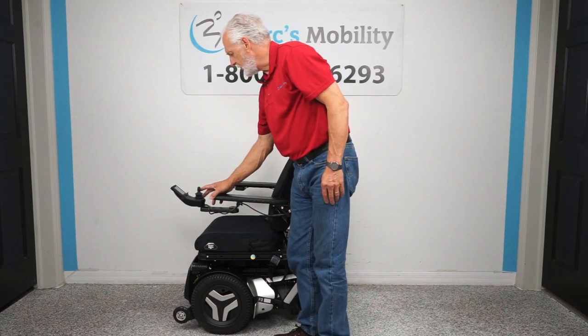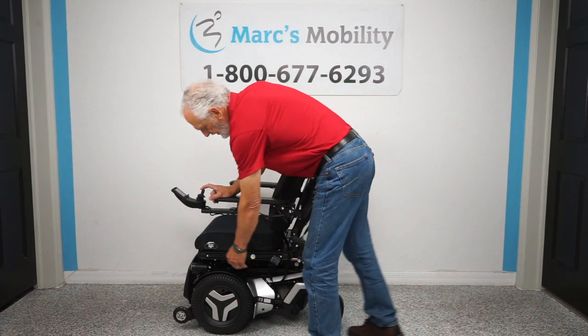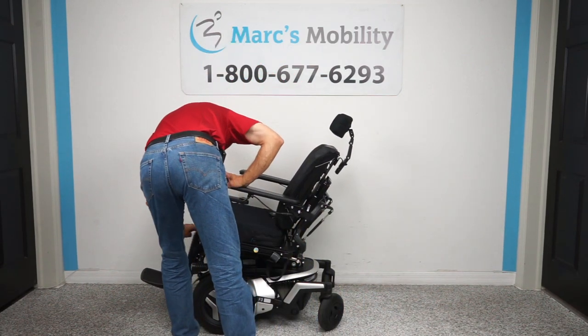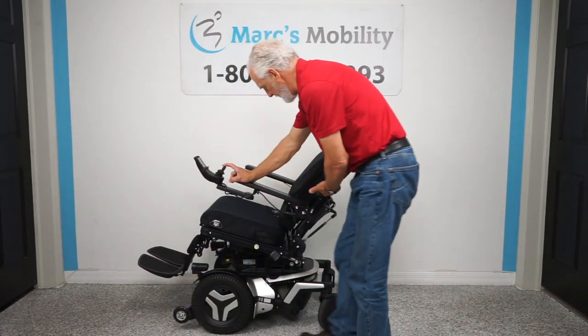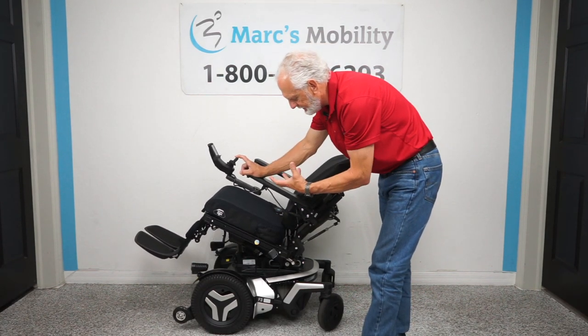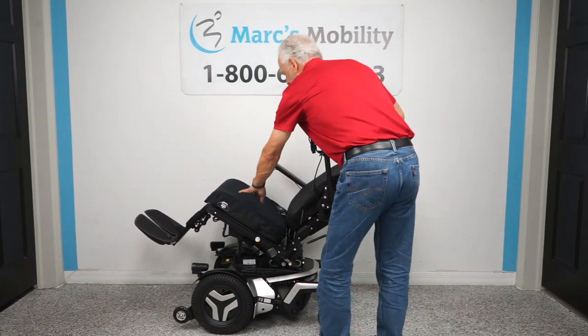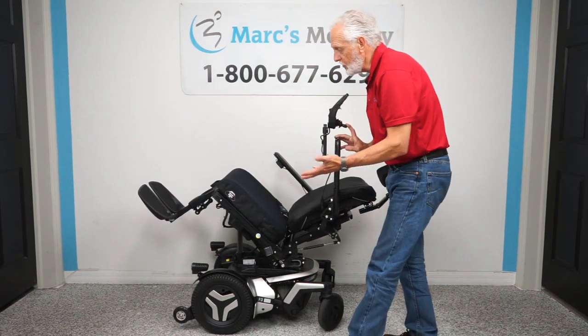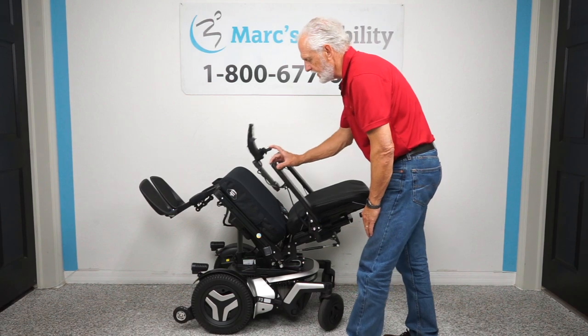The next function is called the electric tilt. The electric tilt is when the base goes back — the legs and the back all go back together because they're all connected. This is really good if you want to relieve pressure off your bottom, pressure off your back, or just want to relax and improve circulation in your legs.